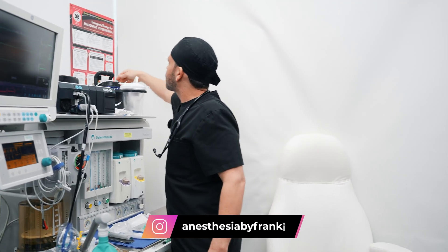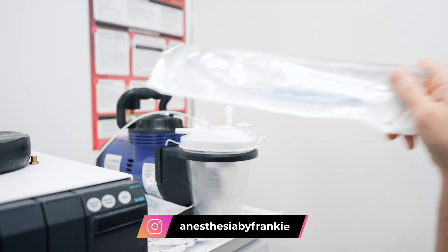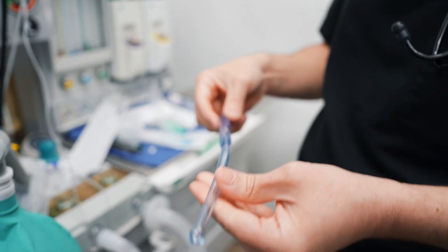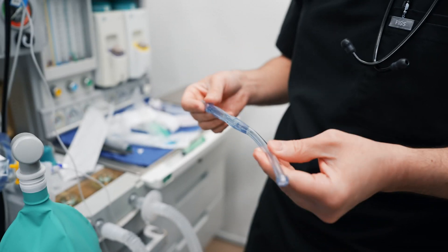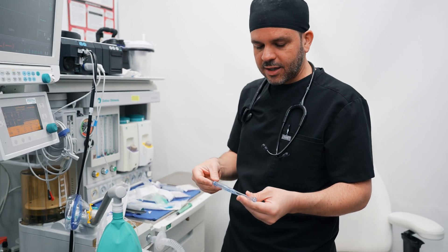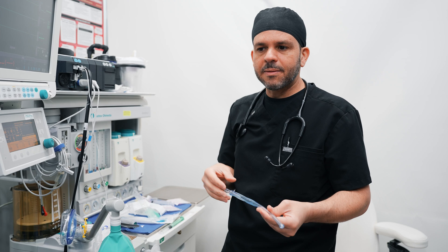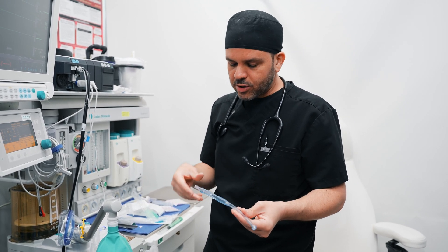I also make sure that my suction is working. My suction is connected to a tubing called a Yankauer, which is used to suction your mouth from any secretions — usually during the end of the case when I'm going to extubate you. Extubate means removing that endotracheal tube at the end of the case. We don't want any secretions getting into your trachea or vocal cords because they can cause a reflex and trigger a laryngospasm or a bronchospasm, which would have to be handled.